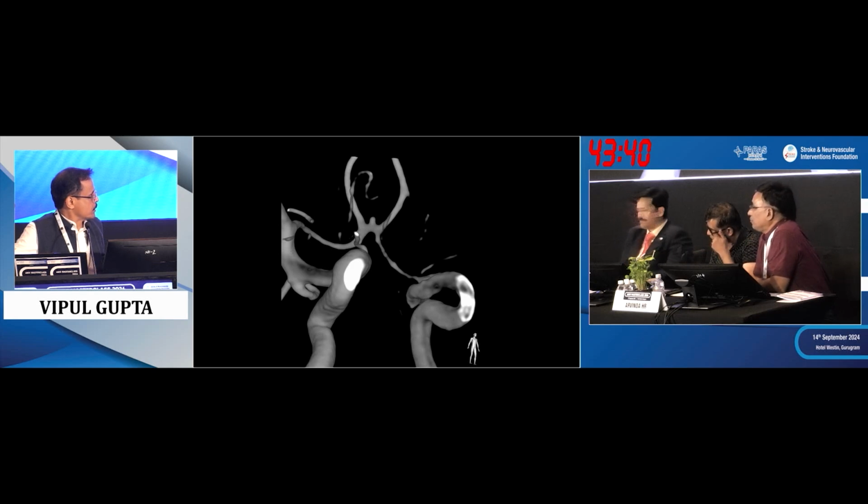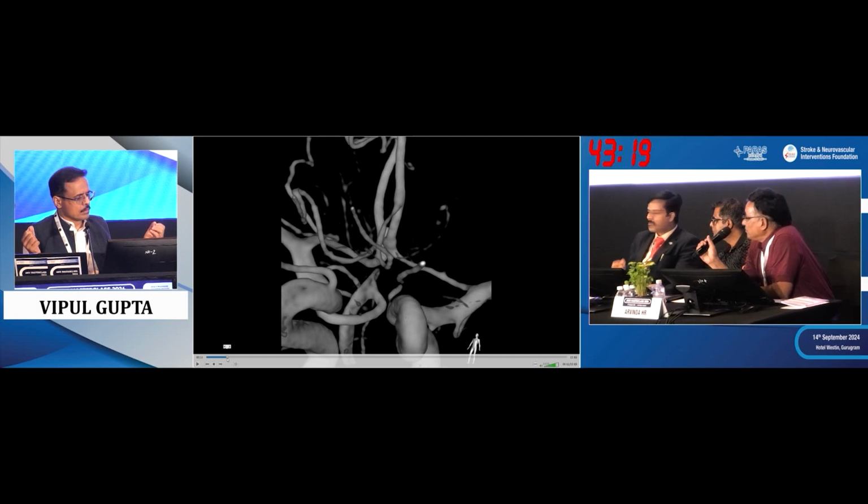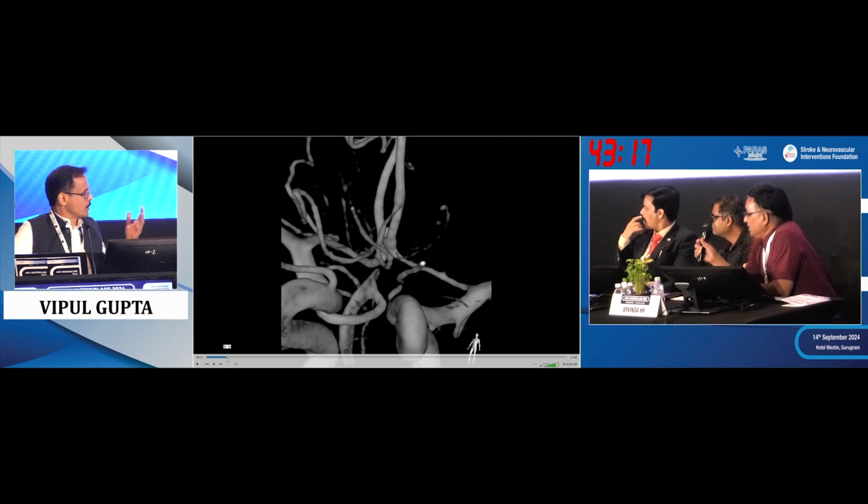So, one stent is there. Can you please place a balloon in the other branch, because coiling is definitely a risky job? So can you place one stent, and okay, the left A1 I thought was too small to place a balloon. Yeah. And even if you place a coil, there was such a broad neck, I think the coil could have run away. But just to prevent the rupture, the backup plan is for a rupture, because placing the coil is really risky. Yeah, you are absolutely right.